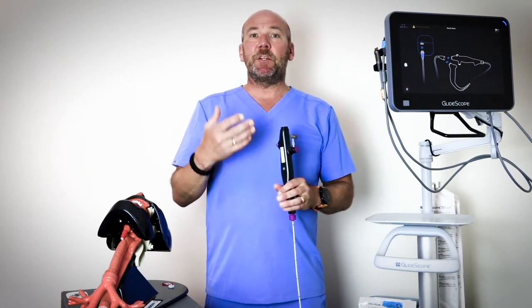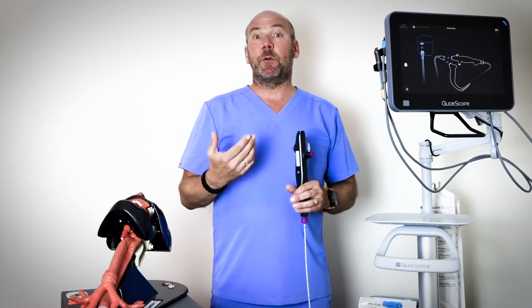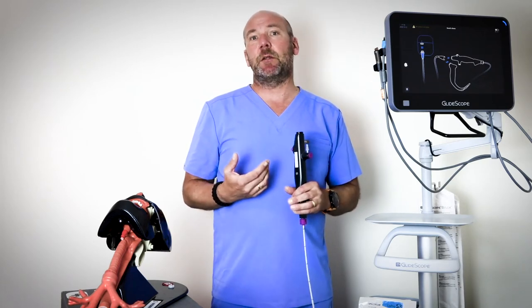In terms of managing difficult airways, the scope can be used nasally or orally, and you're also going to be able to use it with airway exchange catheters if you're doing airway exchanges and those kinds of things.